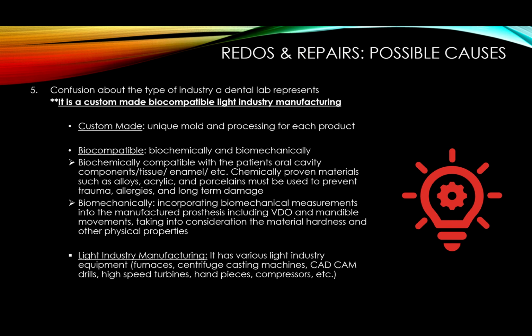All right, we're still in the definition of a dental lab. What's a dental lab? Light industry manufacturing, because we use various light industry equipment: furnaces, centrifuge casting machines, CAD/CAMs, drills, high-speed turbines, high-speed handpieces, compressors, etc. And it's a bit more commercial than what's in the clinic. Even the CAD/CAM in the clinic is a tiny unit, but over here it's really manufacturer size, because we have much more bulk and production than a single clinic, because we serve like 20-30 clinics, whatever. So in other words, you see there are many things that come into the dental lab.